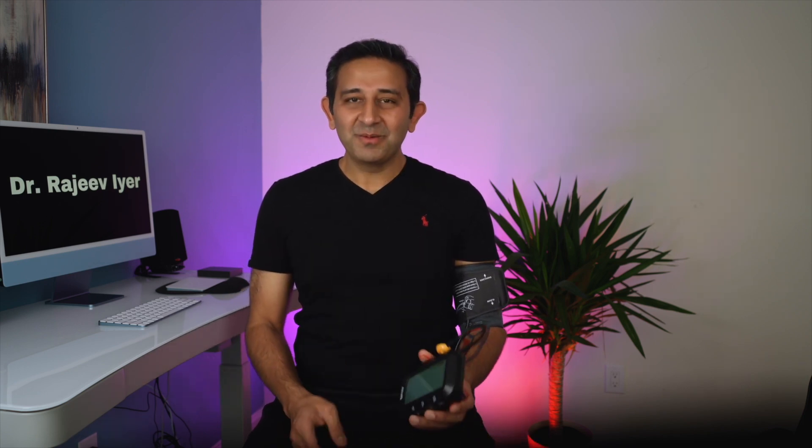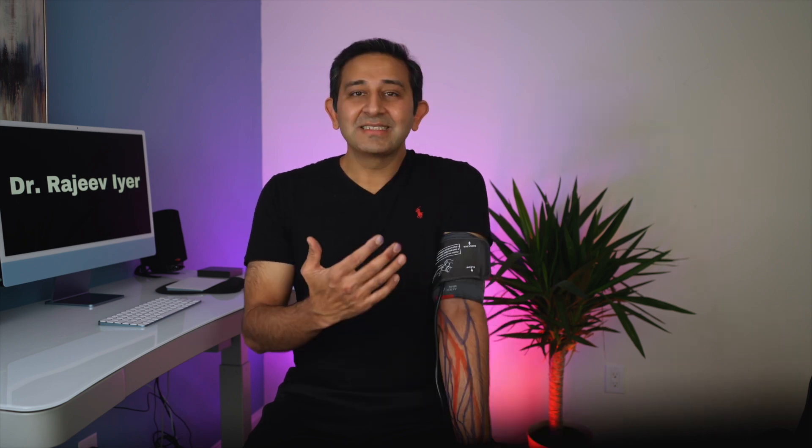Now let's check my blood pressure. I'm going to hit the start button. When the blood pressure is being measured, you can see it puts a lot of pressure on your arm — this is how blood pressure is measured, because it blocks the flow in the arteries. As the air in the cuff goes away, the blood pressure readings are recorded. If you feel a tingling sensation in your hand while it's being measured, that's normal, because of the pressure in the cuff. It takes a minute or two, so just be patient.